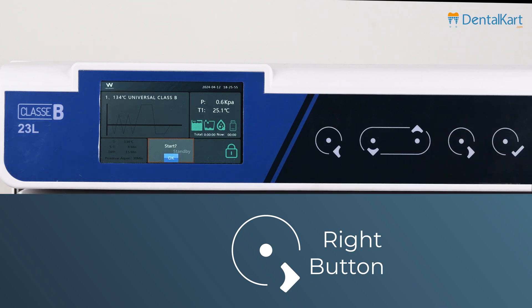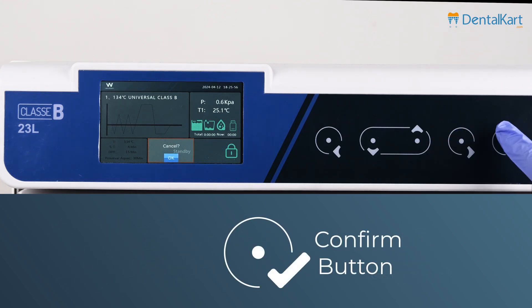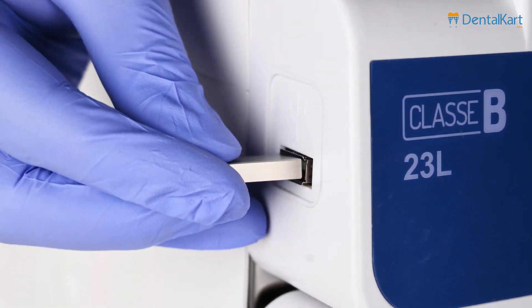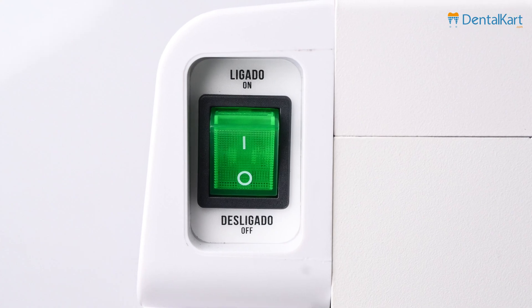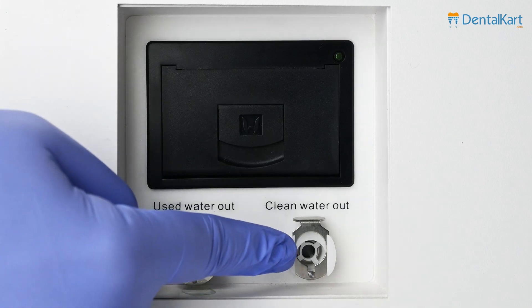The right button confirms the sterilization program. If you want to hold the cycle immediately, press and hold the right button for 5 seconds. Upon seeing cancel, press the confirm button again to terminate the cycle. The confirm button starts the program. On the right side of the autoclave, we have a USB port. On the left side, we have the power switch and printer.